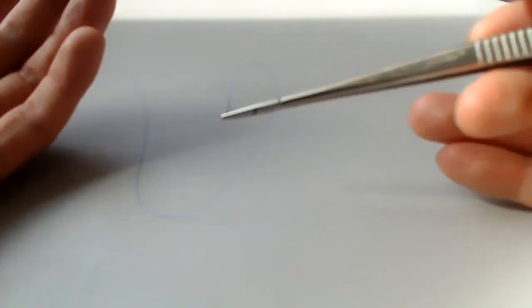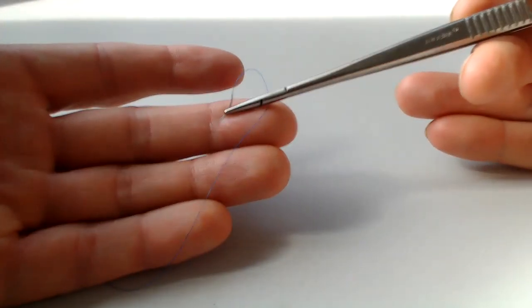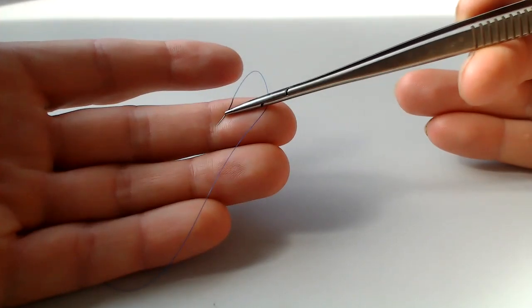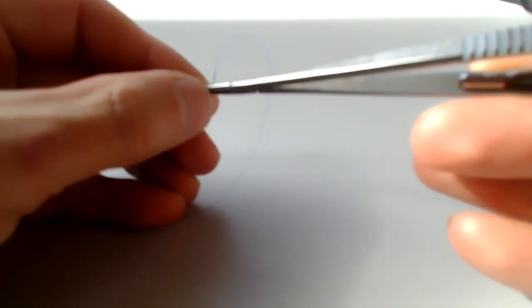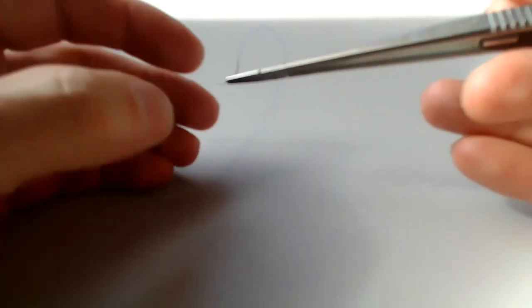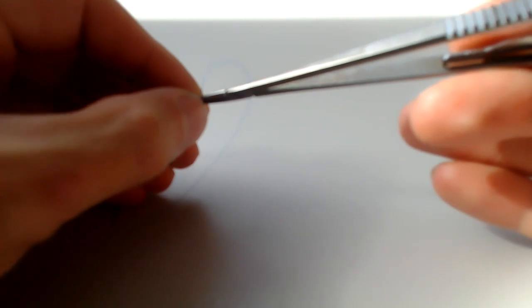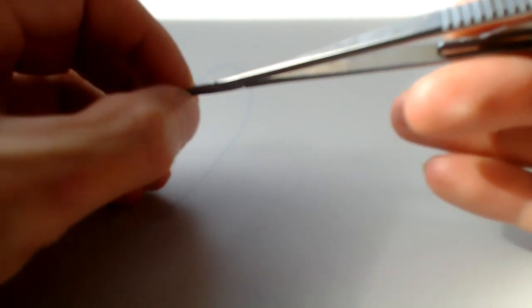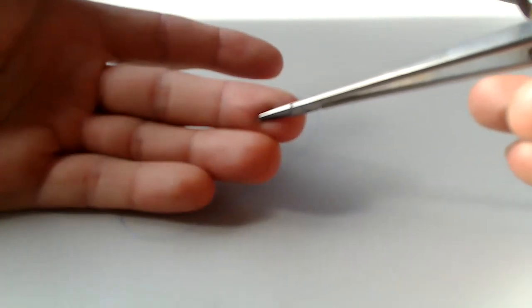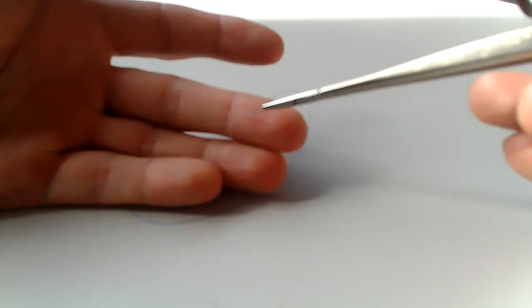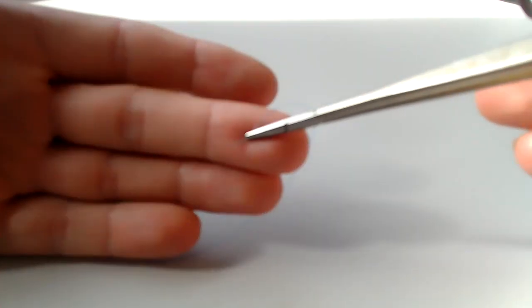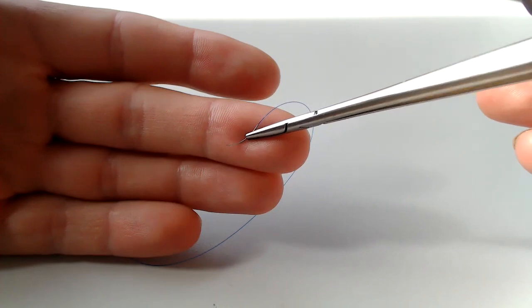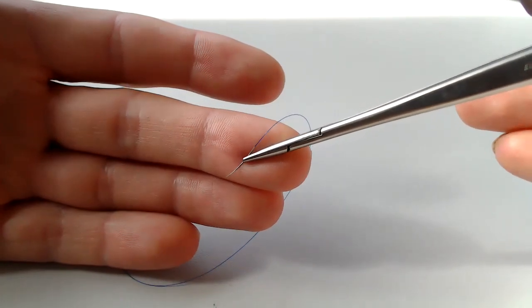I may have it maybe a 55 degree angle. Maybe it's a 50 degree angle. Maybe I'm choking up a little bit more than in other bites. Maybe I am a little bit further back on the needle curve. Pretty much never all the way back there, little adjustments.